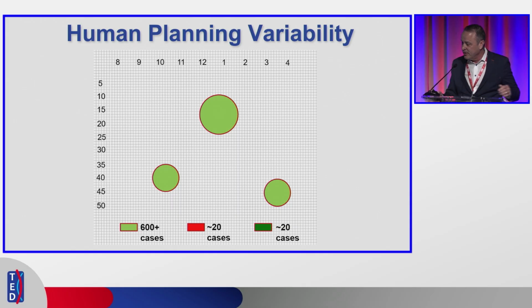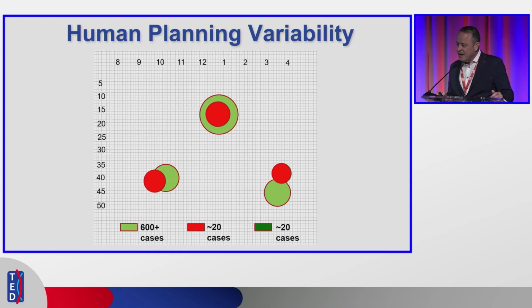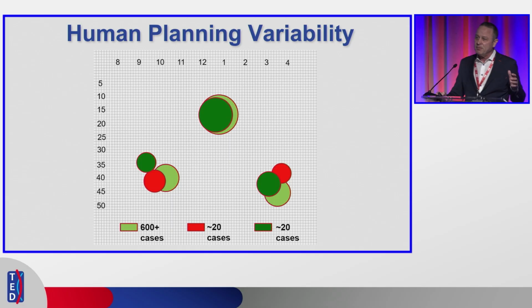So I asked my fellow in red to size this case. Mind you, I taught my fellow how to size these cases, and this was his plan. When we line up the SMA, he loses the left renal artery. Then I asked my chief resident to size it, and she sized it here. When we line up the SMA, she loses the right renal. Now how can that be? How can it be that two people I trained to size these cases could be so wrong?